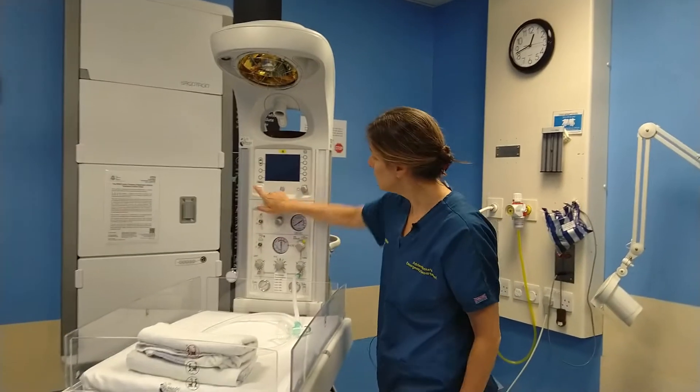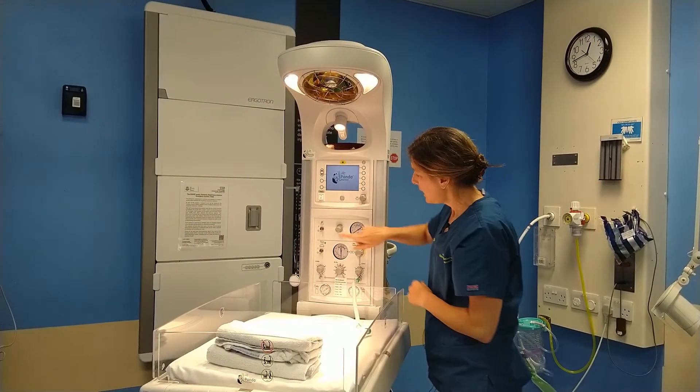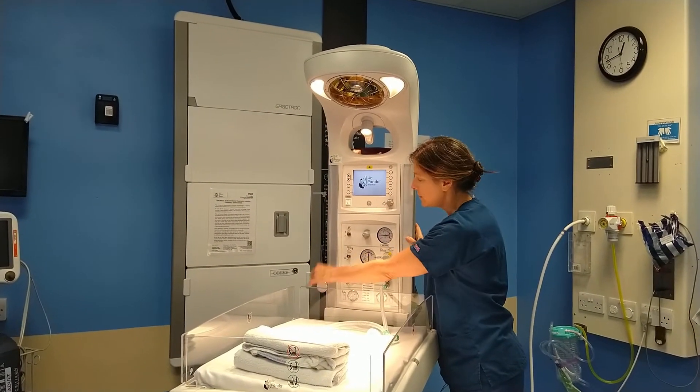On the front of the machine you've got the main on switch. Switch it on, the heater will come on and the light will come on. And then across this panel you've got suction. The suction equipment is down the left-hand side of the machine.